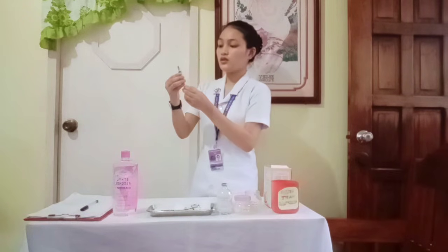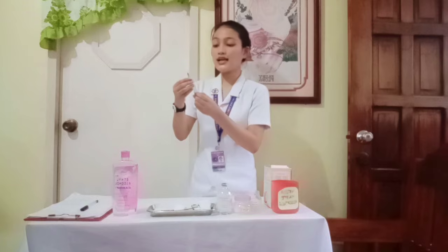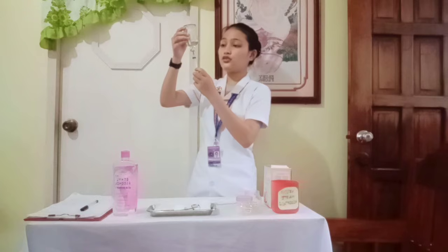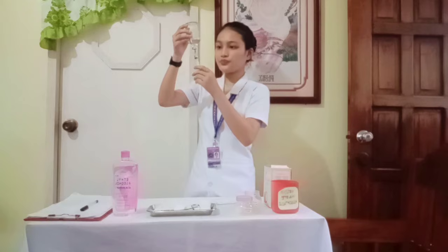And then take the syringe, uncap the syringe. Now draw air into the syringe. The air to be drawn inside would be equal to the amount of the medication needed as prescribed by the doctor. And now inject the air into the vial. Invert the vial and draw the exact medication needed. So it would be 1 ml or 1 milliliter. And there is no air bubble.